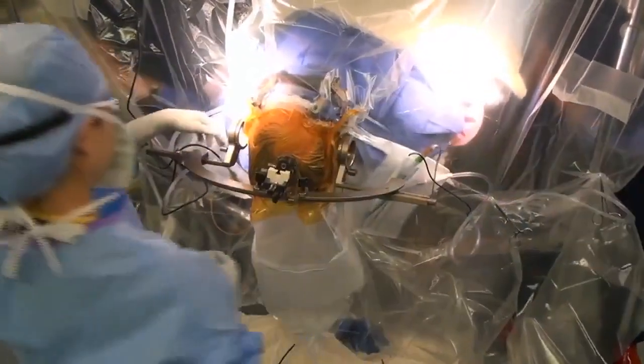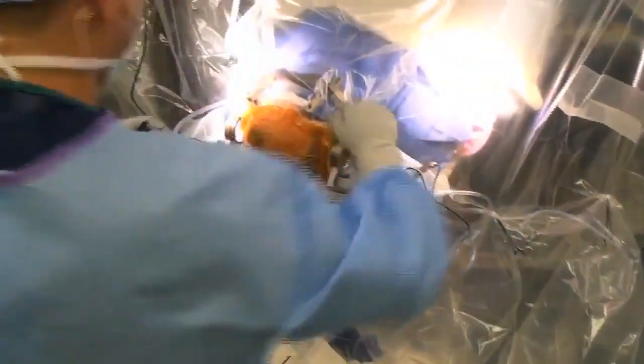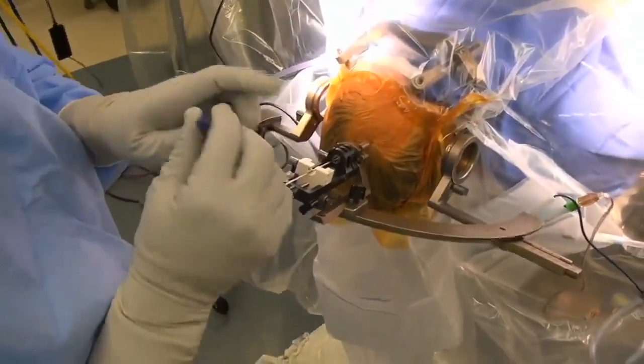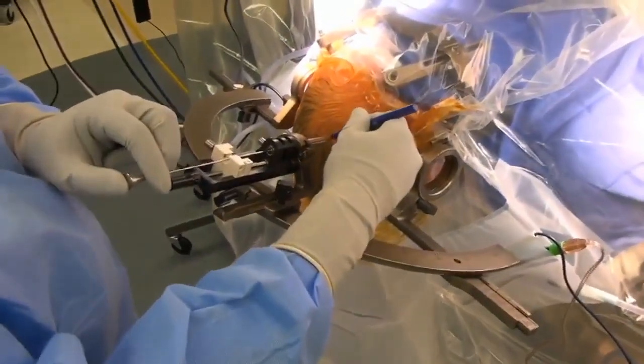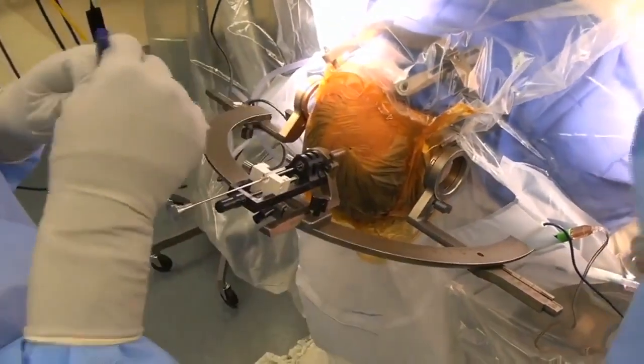Let's go ahead and countersink. A little countersink. Okay. All right. So this is kind of what we did roughly earlier, but now this is a more precise manner for identifying that entry point. So that's our spot right there.